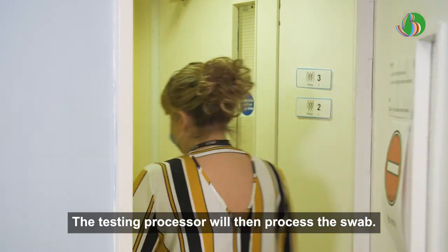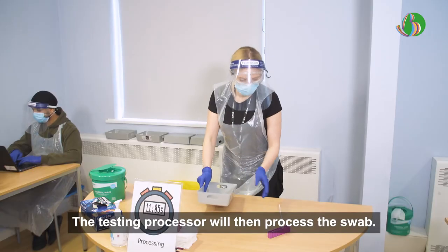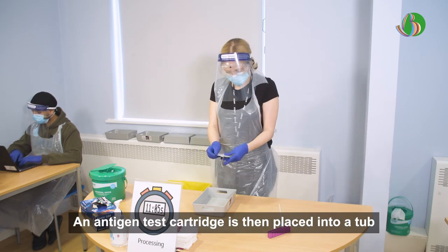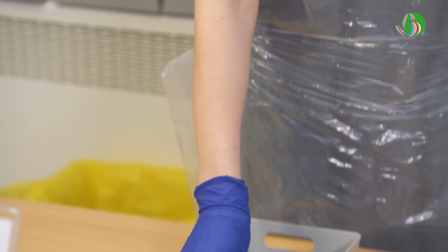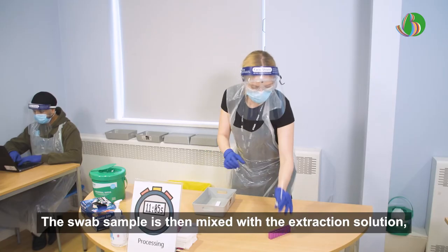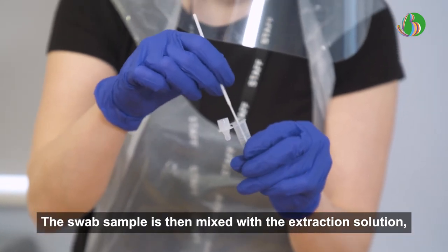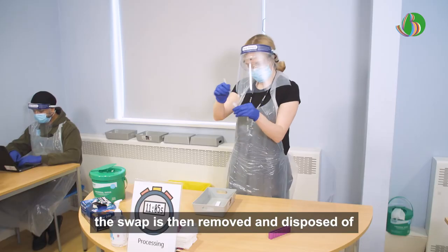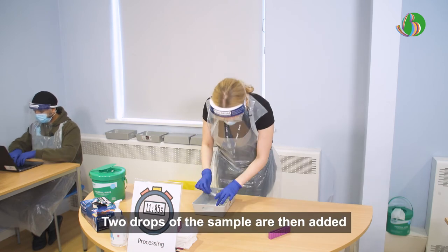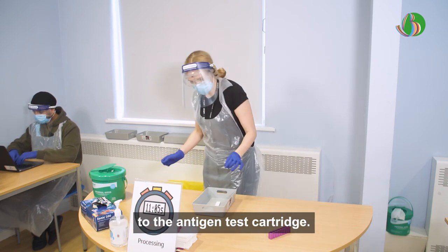The testing processor will then process the swab. An antigen test cartridge is placed into a tub. The swab sample is then mixed with the extraction solution. The swab is removed and disposed of into the medical waste bin. Two drops of the sample are then added to the antigen test cartridge.